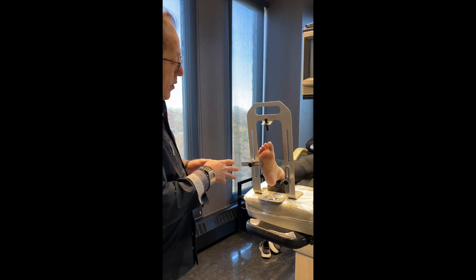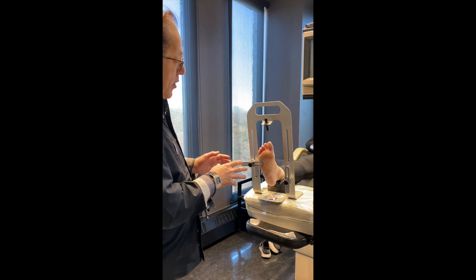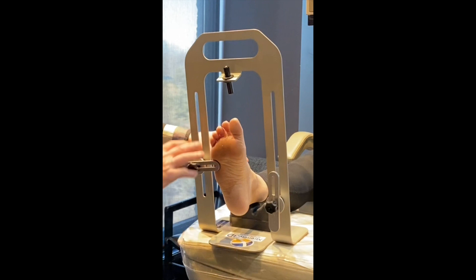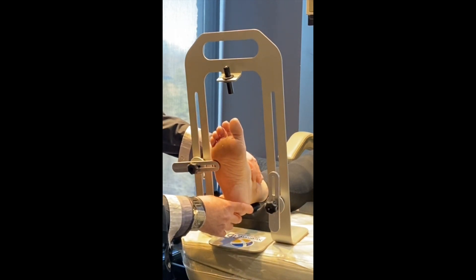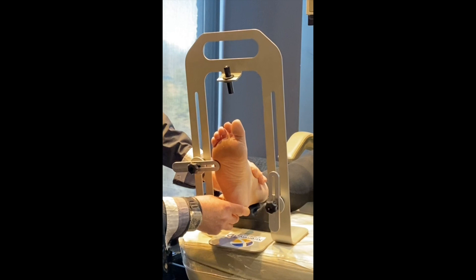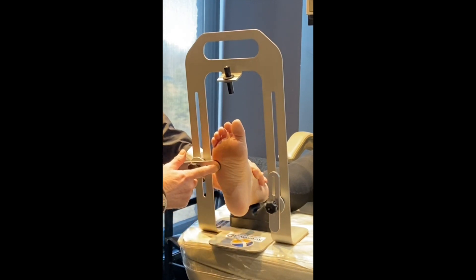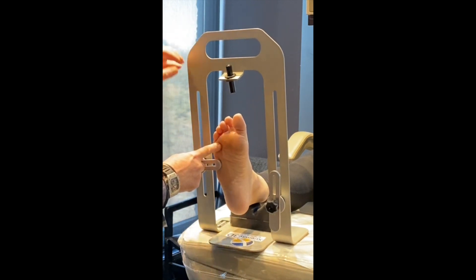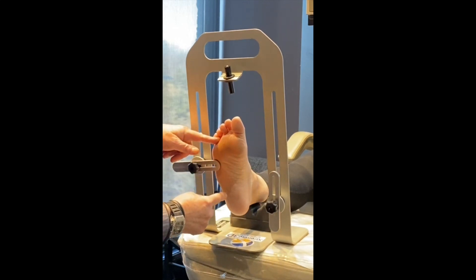What it does is it holds the foot in proper neutral position — the position we want to capture the scan. As with any orthotic casting, you want to put the foot in subtalar joint neutral. The beauty about this particular unit is that you can move this bar up under the fifth metatarsal so the foot is held in proper position in neutral. Then we turn on the laser, which sends a laser light down the plantar surface of the foot so we know we're in good position.